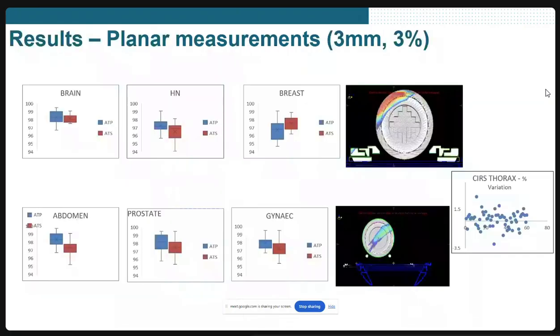Coming to patient-specific quality assurance, it is almost similar to what we do on a conventional LINAC. The important point you should remember is that the dosimetric equipment you use on a conventional LINAC cannot just be taken into the MRI machine, because it has to be MRI conditional or MR compatible. MRI conditional, at least you can use it. If it is not MRI conditional, you cannot take it in, because the phantom can really get stuck to the machine and you will lose the phantom as well as damage some part of the machine. So you have to be very careful about which chambers, electrometers and phantoms are allowed inside the MRI room.